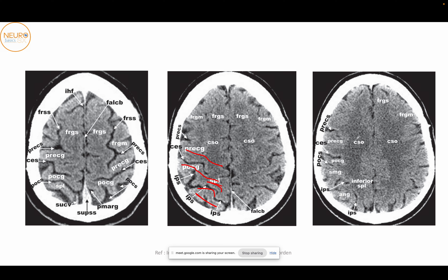As we go further inferiorly, you can see more of the centrum semiovale, the quite thick precentral gyrus and the much thinner postcentral gyrus, and the central sulcus. Behind the postcentral gyrus, at a much lower level, you will see the inferior parietal lobule. This is the supramarginal gyrus, which is the superior part of the inferior parietal lobule, and this is the angular gyrus, which is the inferior part of the inferior parietal lobule.